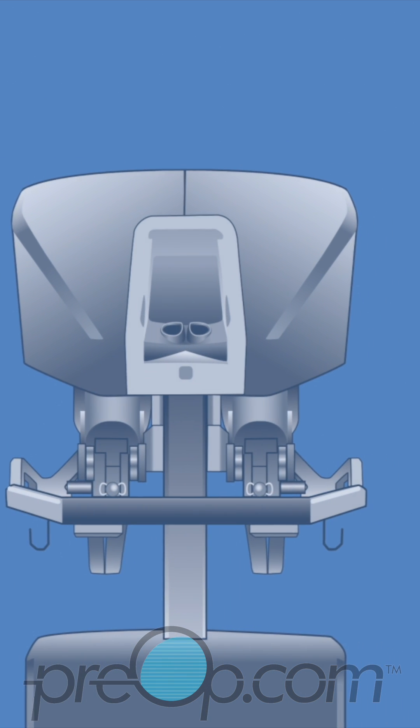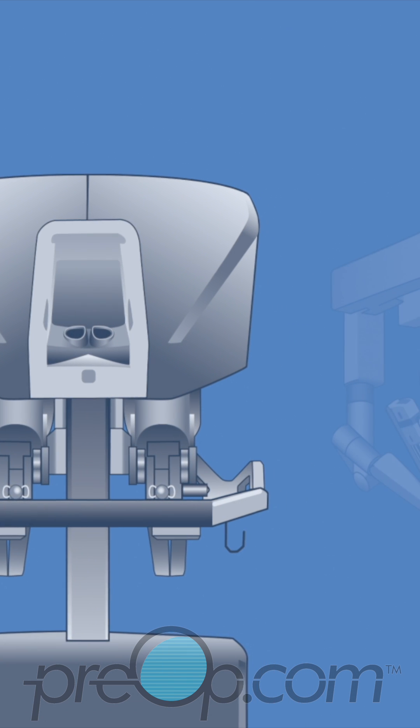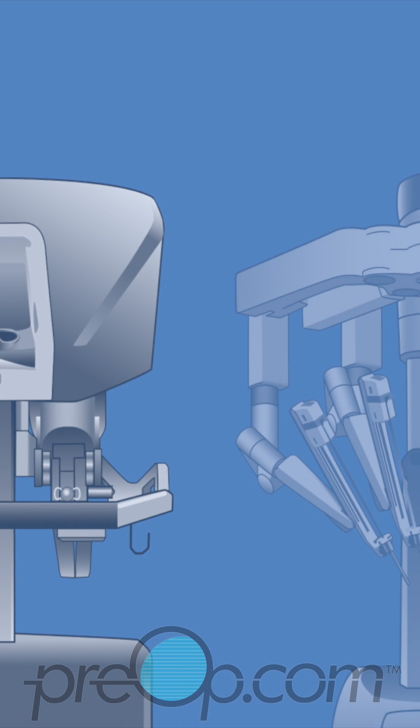The tower has a video screen for the team and surgeon to see the surgery in high definition.